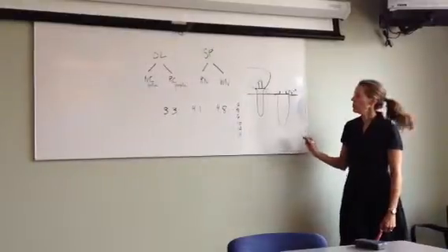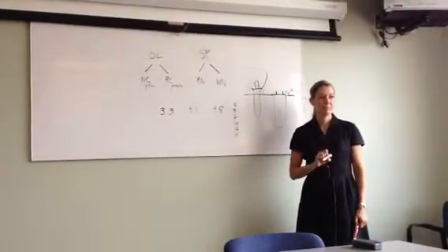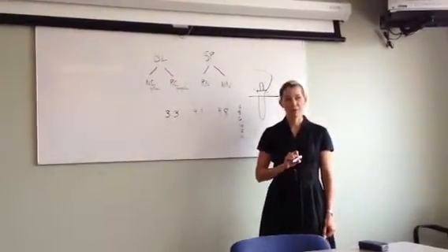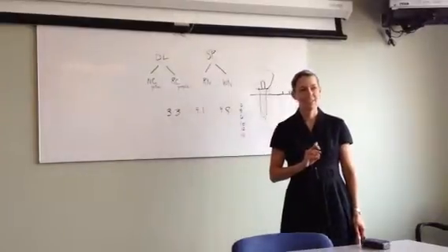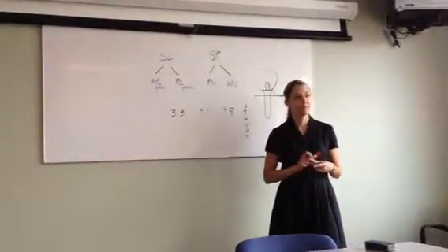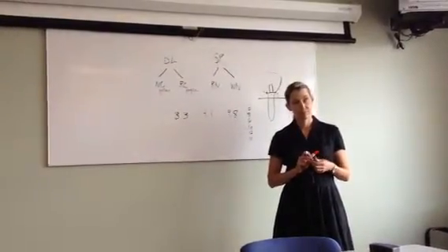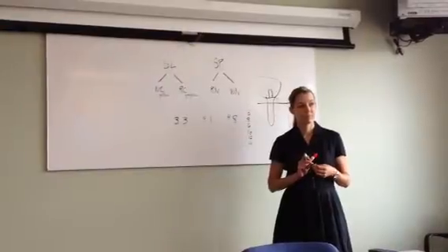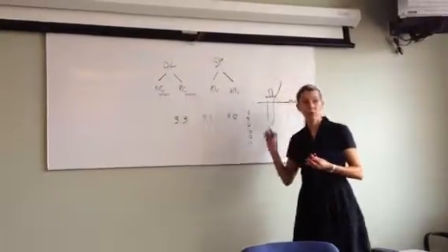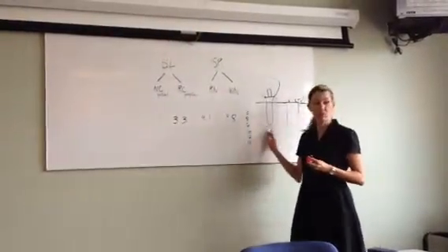Why, oh why, would you use a tissue level implant? Simplicity. Can you talk about that more? You don't have to do stage 2 surgery to uncover it later on, so it's faster to restore. And it immediately conditions the tissue at the time of surgery instead of having to do an additional healing abutment stage. Although with the bone level, you can put an immediate healing abutment on. Yes, you could. But all of those things are correct.